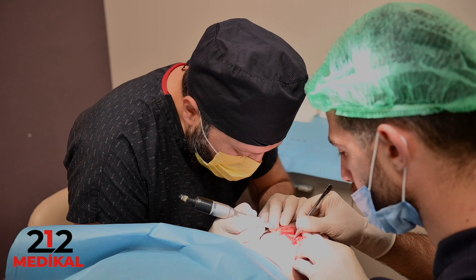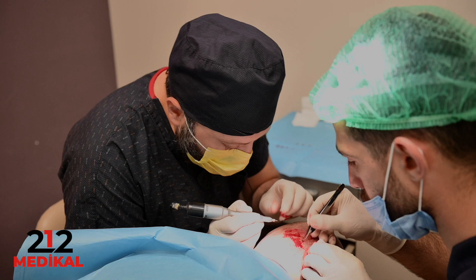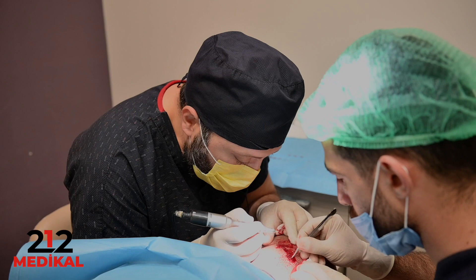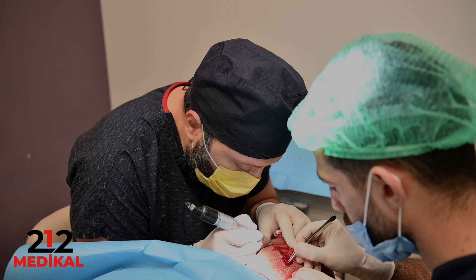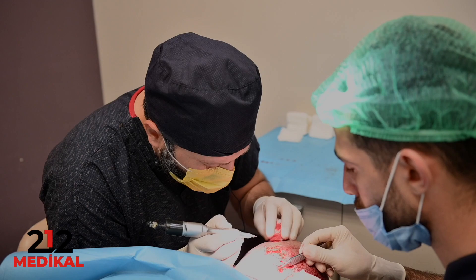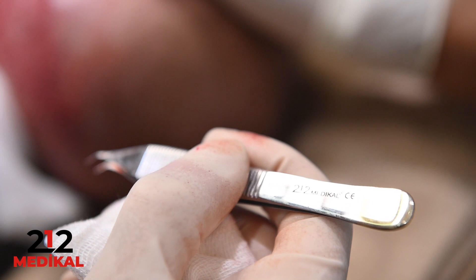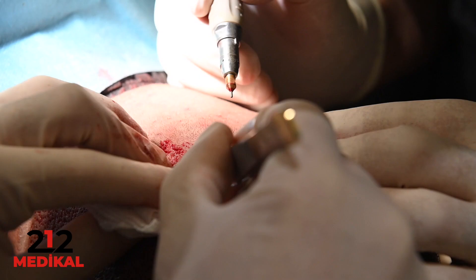Don't forget that deciding punch length and diameter before and during surgery is very important. Always, the sharpness of the punch, the company quality, and the metal quality are critical. A lower-quality or hollow punch will not perform effective extractions.